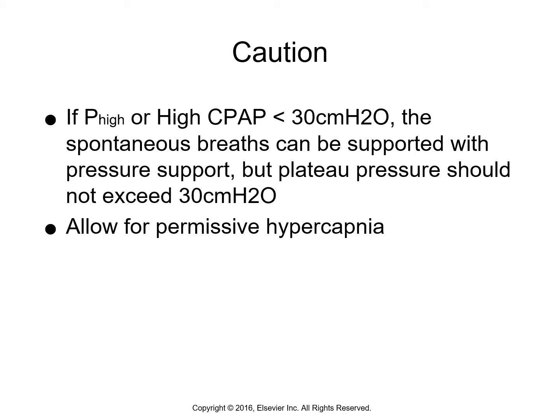The shorter video, he does a lot of education on APRV and on the Puritan Bennett. Unfortunately, with us not being in class, I can't schedule any of these, so you have to rely a little bit on YouTube. Also, remember we may have to allow for permissive hypercapnia.